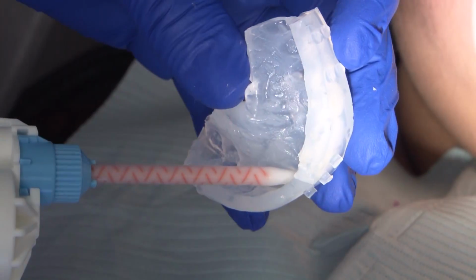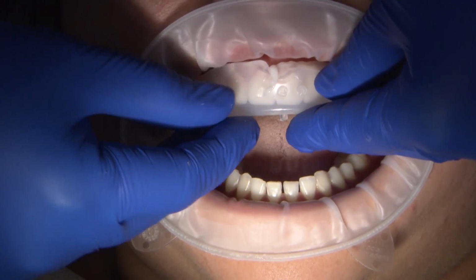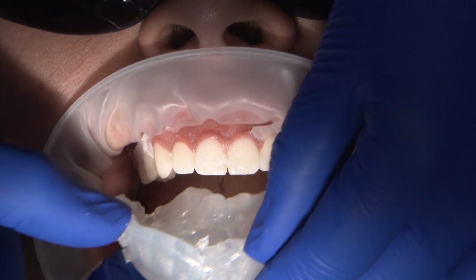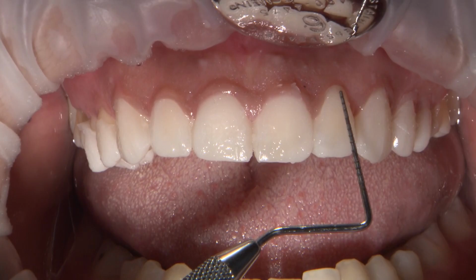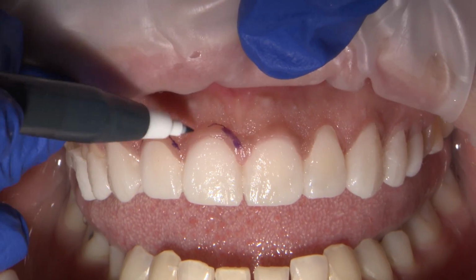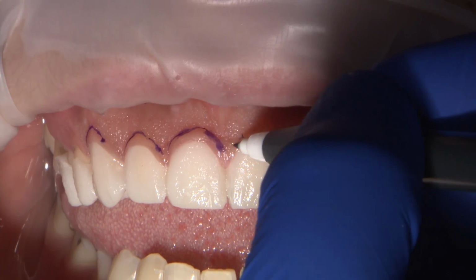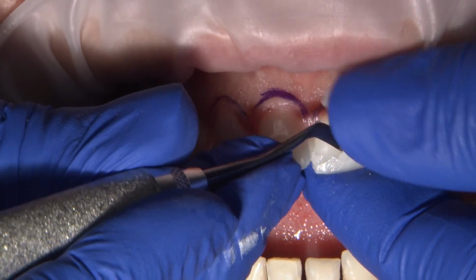I always start the process by looking at the incisal edge position. Then I continue looking at the tooth proportions versus gingival display, and most importantly, at the osseous crest position. To help in communication, I showed the patient that only closing the spaces will not address the gummy smile and the tooth proportions. To determine the ideal gingival margin that will suit the patient's smile, I created the markings and showed the patient that the actual gingival margin has to be moved more apically.